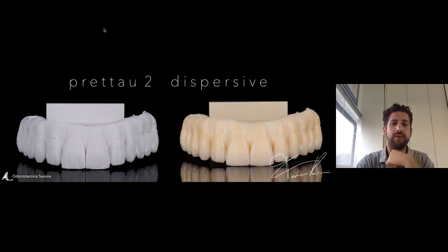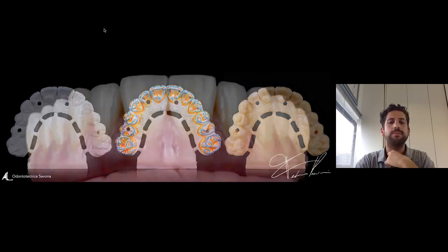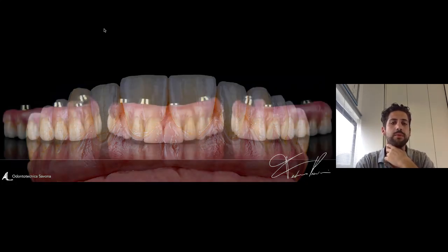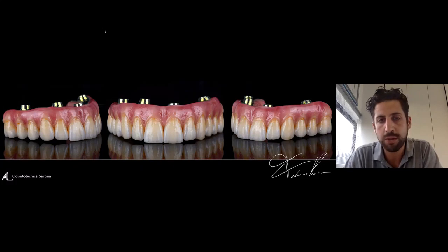This is the result after the milling and after the sintering. This was an older patient, so we had the possibility to make some really nice characterization of the surface. We start with the infiltration, so we put orange, cervical, and some dentin C to get this kind of effect. This is the bridge already glazed, already finished with the layering of the gingiva. We glued our titanium bar, always in gold.